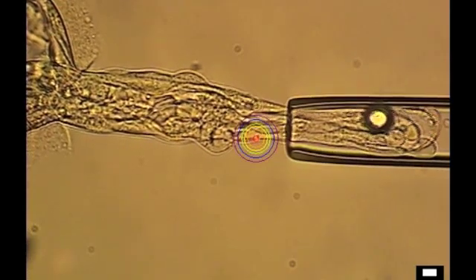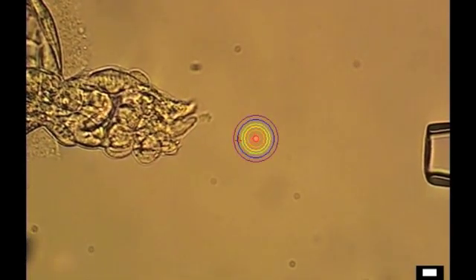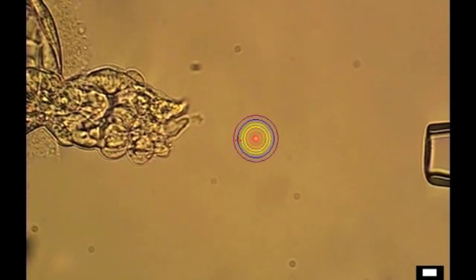The material that was just removed from this embryo is material that would otherwise be destined to become the membranes of pregnancies, such as the placenta and other membranes.